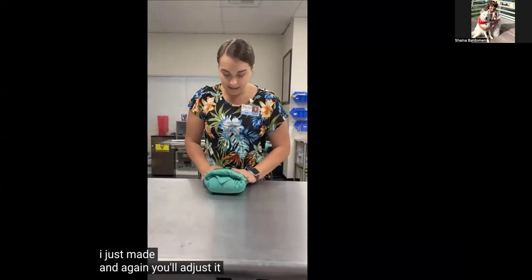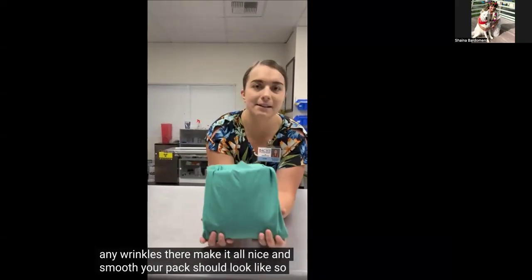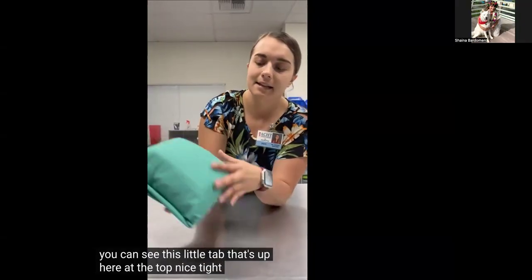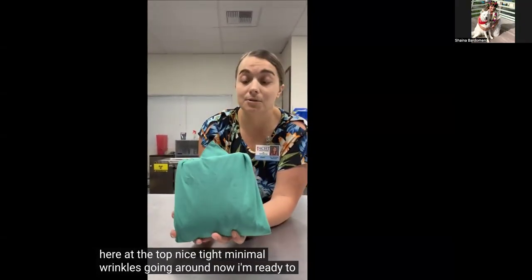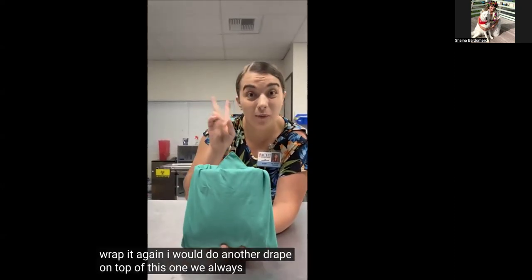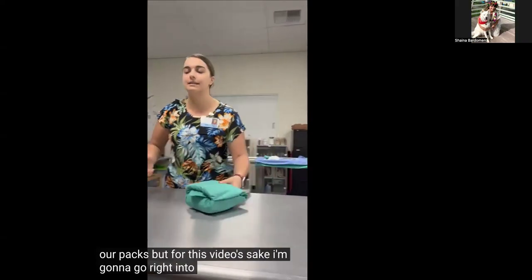And again, you'll adjust it if there's any wrinkles there, make it all nice and smooth. Your pack should look like so. So you can see this little tab that's up here at the top. Nice, tight, minimal wrinkles going around. Now I'm ready to wrap it again. I would do another drape on top of this one. We always double wrap our packs, but for this video's sake, I'm gonna go right into taping.